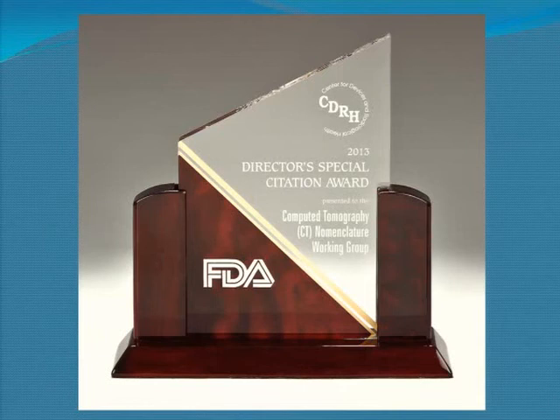Yes? So if you're having, let's say for an example, an abdomen protocol, how many different sizes would you have? Small, medium, large, or? Okay, so the question is, for an abdomen protocol, how many different size protocols do we have? And right now we have two. We have sort of small and average, and we have large. We've kind of moved around with that, but right now there's just two.